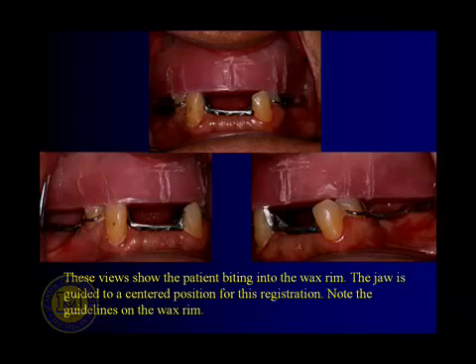Okay? So we go ahead and we glue the maxillary record base in with the wax occlusal rim after we've adjusted it so we think it's pretty good. And I ask the patients now, please moisten your lips, open, and bring your lips down till they just comfortably touch together. And I have them do that 2 or 3 times. And I want them to just let their lips relax together, have them breathe through their nose.